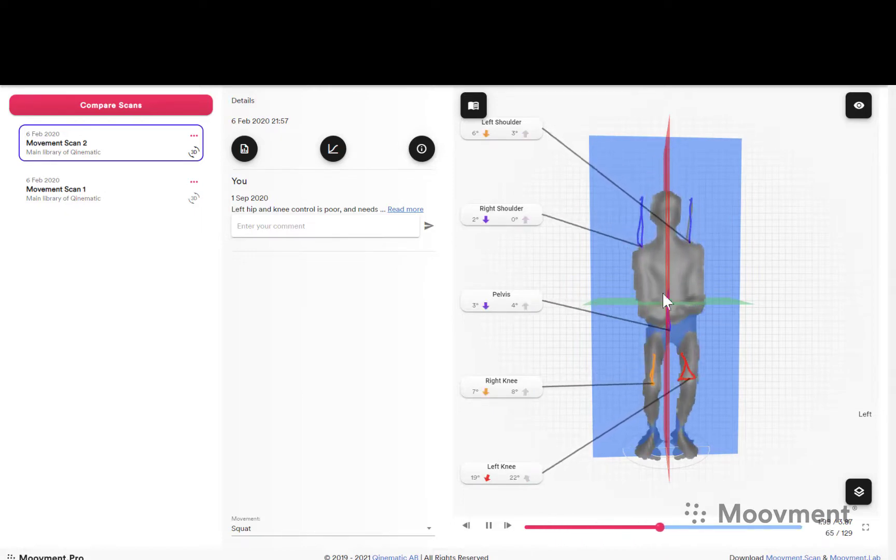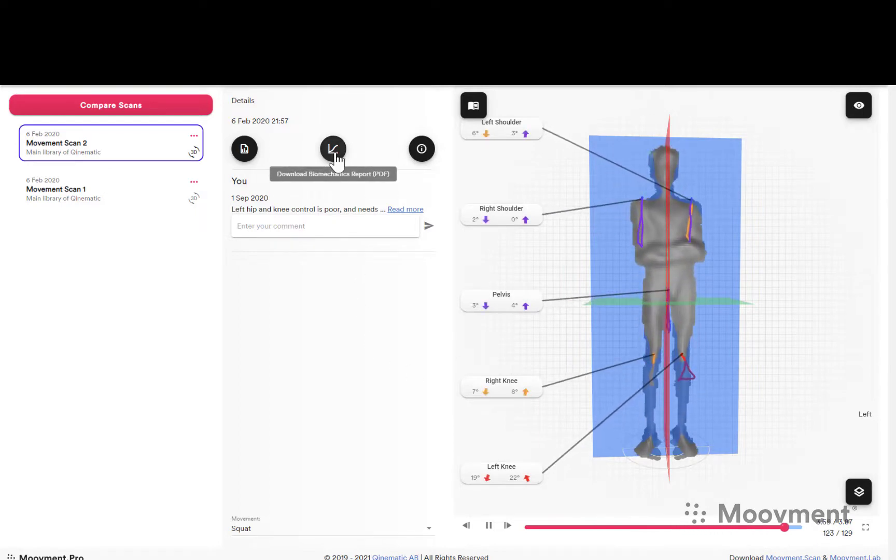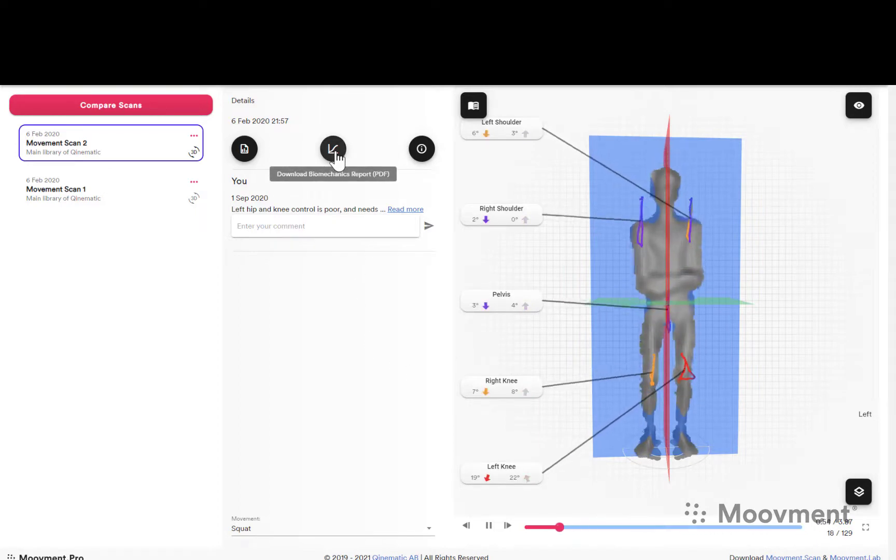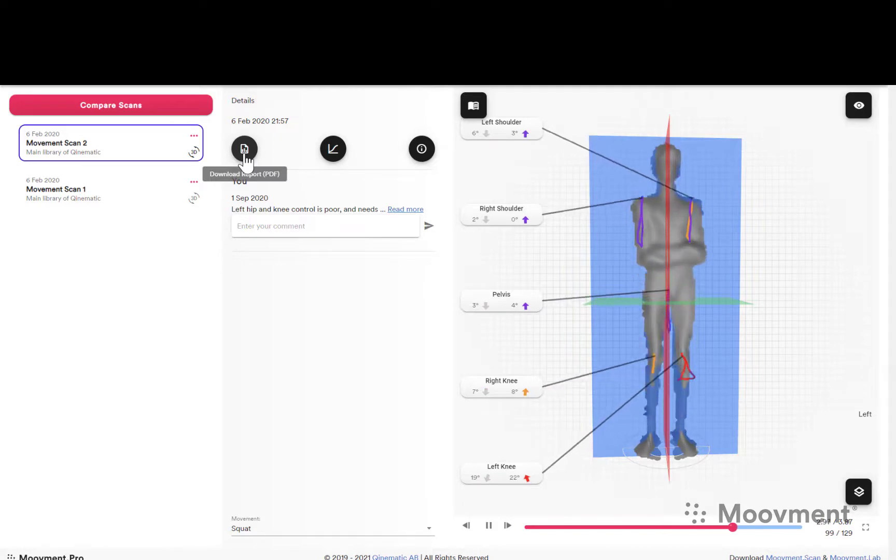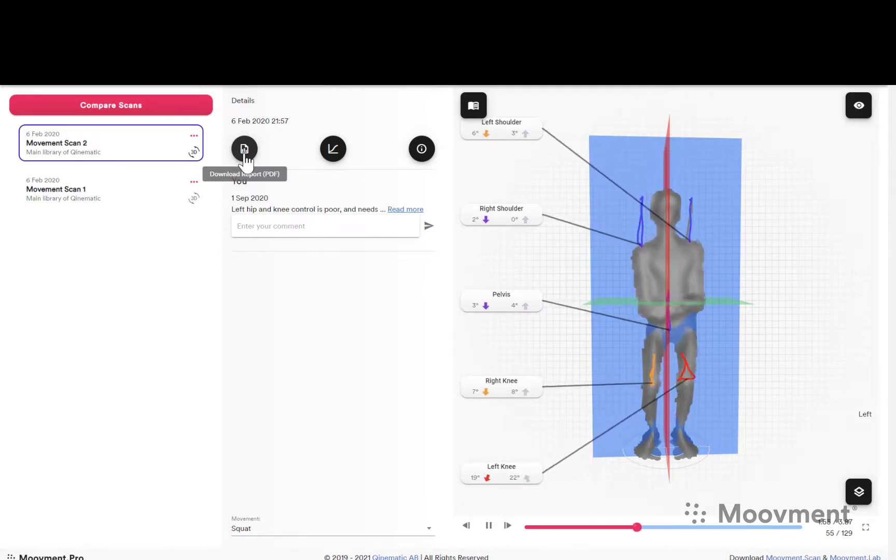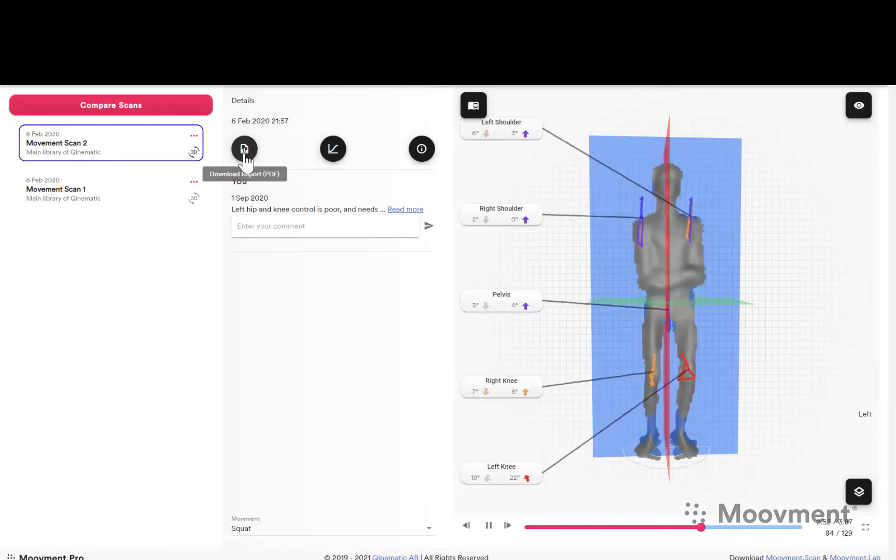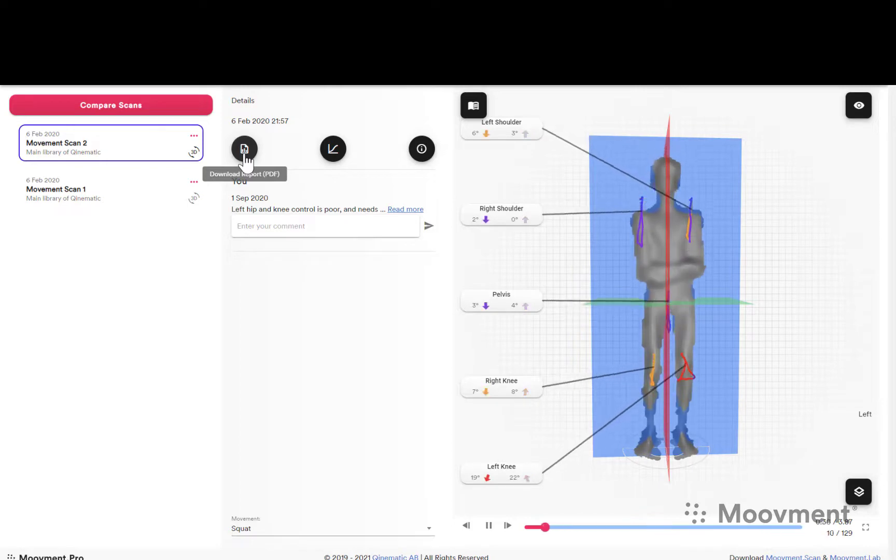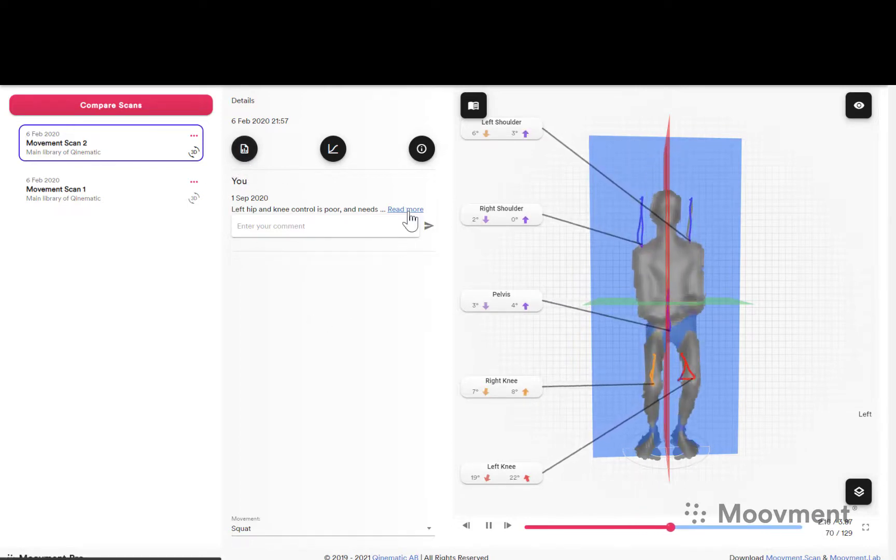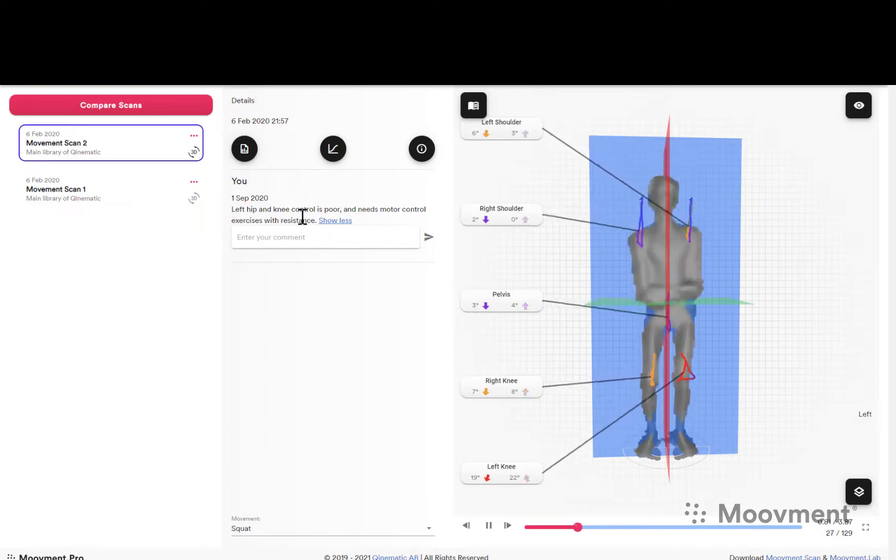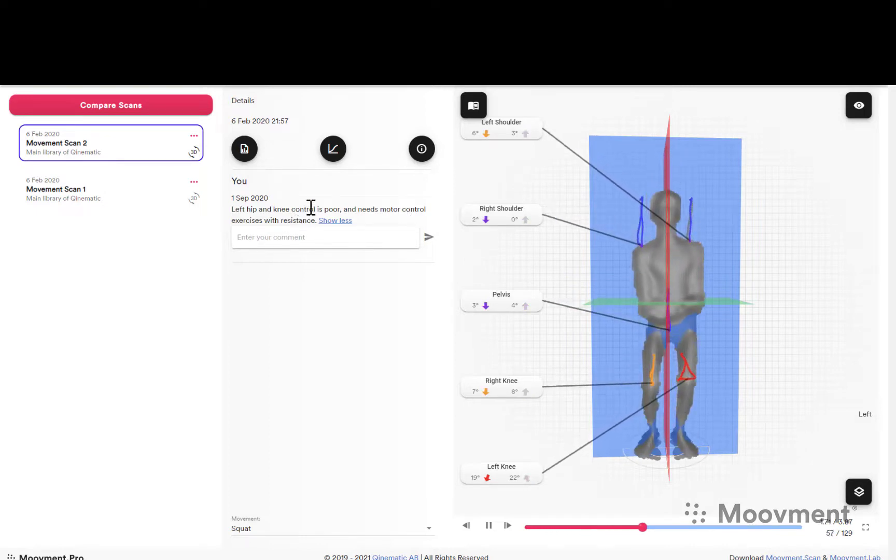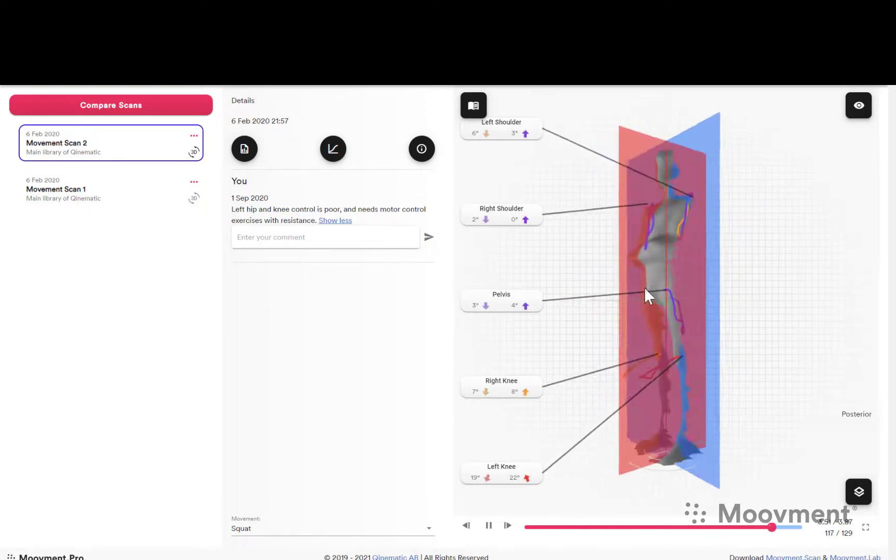From here you can also generate a biomechanics report and you can generate a summary report for the patient inside the app environment, so there's no need to email or print or anything like that. And you have the opportunity to write comments, and then those comments can be sent to the individual.